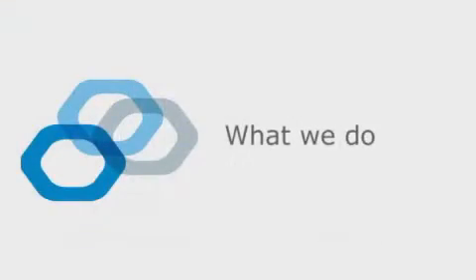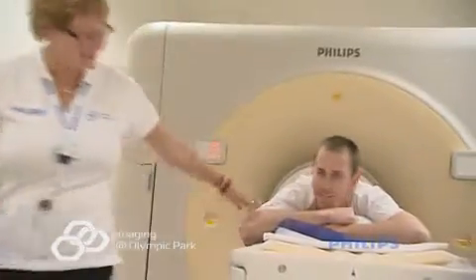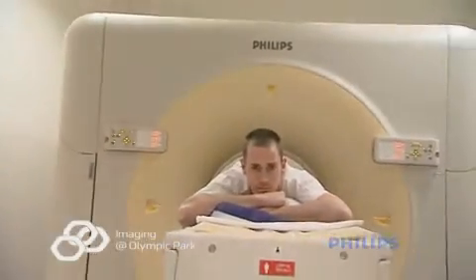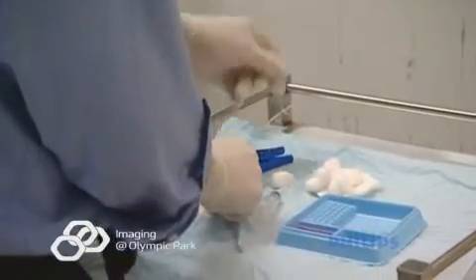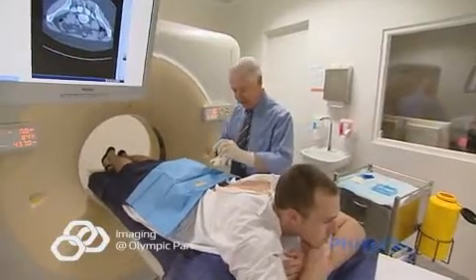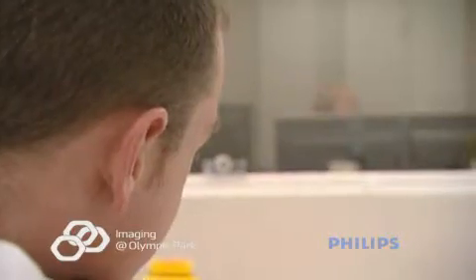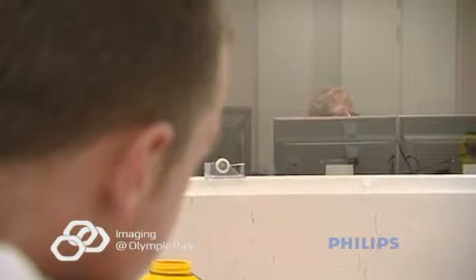What we do. There are many ways to treat conditions of the musculoskeletal system. Your doctor has recommended a CT-guided facet joint injection. This involves the injection of cortisone and local anesthetic inside the small joints found in the neck or lower back. Cortisone is a powerful anti-inflammatory and pain-relieving medication that has been used to treat patients successfully for many years.